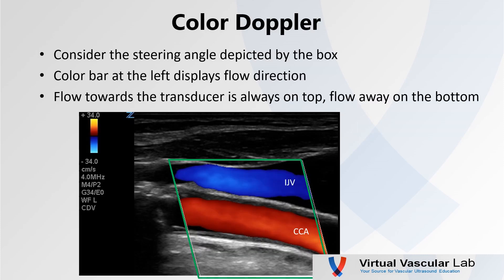Let's consider this color Doppler image of a common carotid artery. The first thing we need to do to interpret it is consider the steering angle depicted by the box. We know that our look angle, or angle of insonation, is coming in along the arrow. We see the color is red. We look at our color bar on the left — it always displays flow direction. Flow towards the transducer is always on top, flow away is on the bottom. Therefore, we know flow in that common carotid artery is moving from right to left.